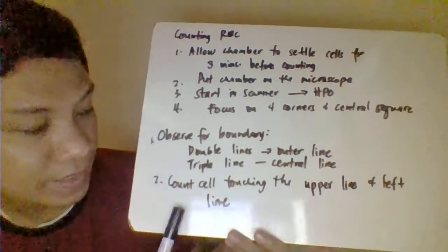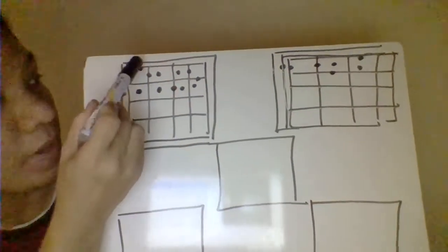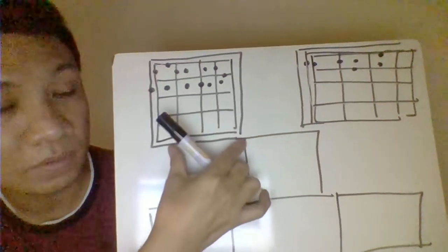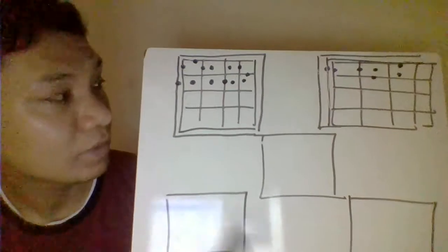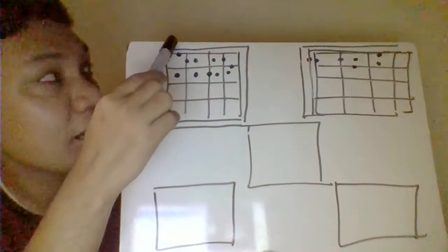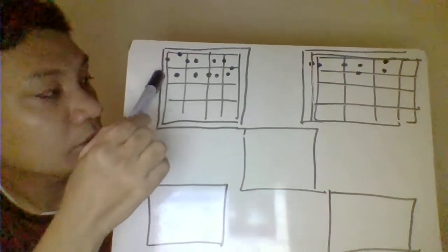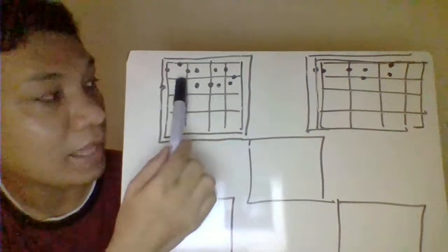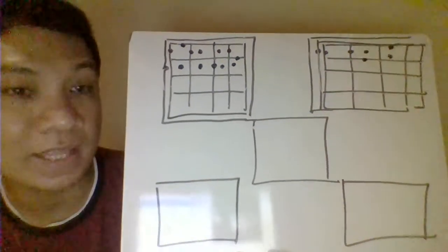Okay, another one, you count the cells here touching the upper line and the left line. So, pag sinabing upper line, so itong upper line natin, ito yung left na line. Paano tayo magka-count? So, una muna, dito ka magka-count. So, depende pala sa'yo kung gusto mo. Basta you try to count here the 5. Okay, so dito ka muna. So, like for example here. One direction lang dapat tayo nag-count. So, pwedeng pa ganyan. Dito ka mag-umpisa sa square na to, papunta dito, pababa ka, then ganyan. Okay, so basically lahat ito ay ka-count natin. And each of that one, lalagyan mo siya ng bilang or count natin.